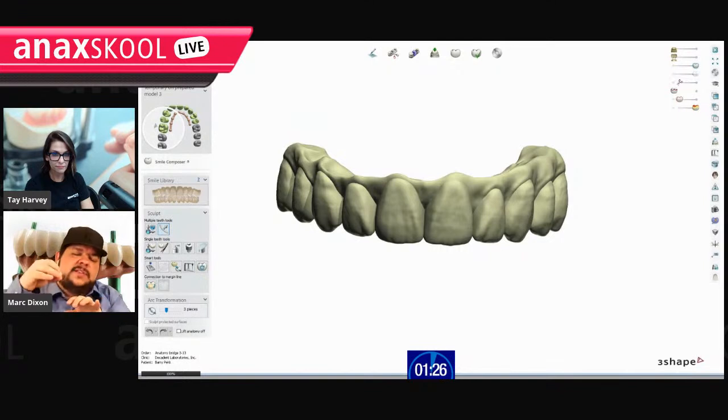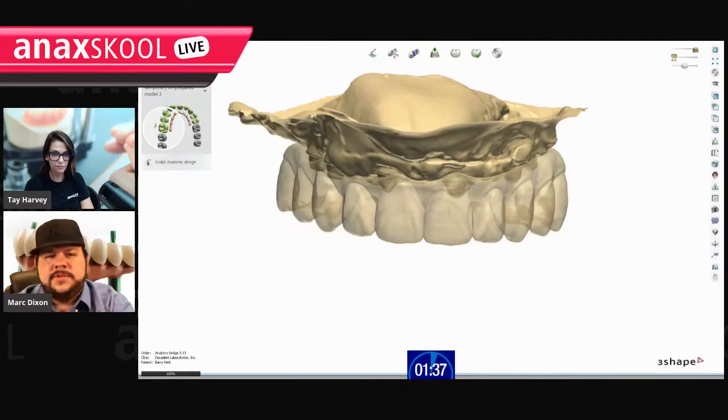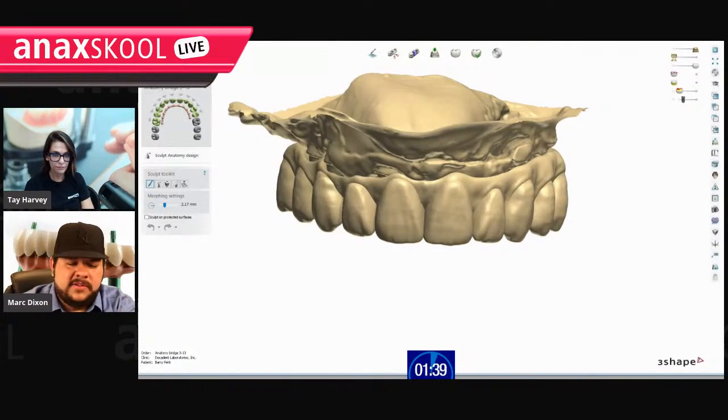And we're just going to bring that out a little bit. There's meshes within the software that you don't see. You don't need to see them. We have our visual 3D models and our utility 3D models. And with implants, there's two utility models that we use. One is the subtractive normals of the interface, where to cut, what I was telling you about earlier with the implant. So it cuts away at your model.